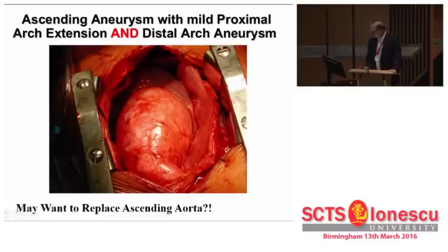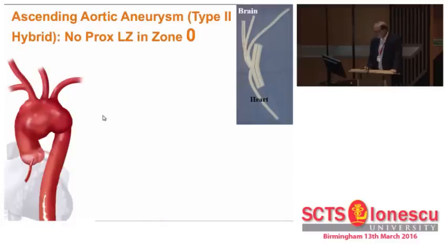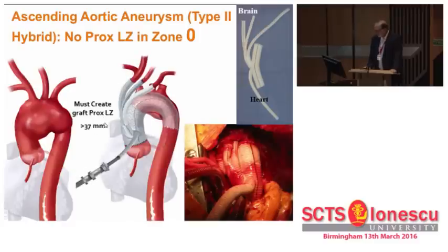It's that simple. So, ascending aortic aneurysm in mild. This is an example of a case, for example, that has a large ascending aorta. So we're not going to be able to land a stent graft into this zone 0. So this gets into the concept of the type 2 hybrid concept. If we have something like this, we're going to have to create a new landing zone.